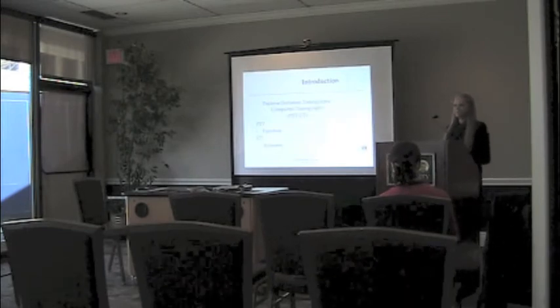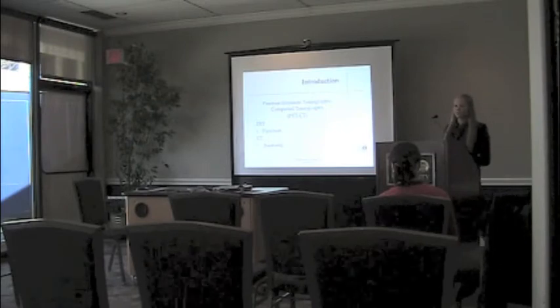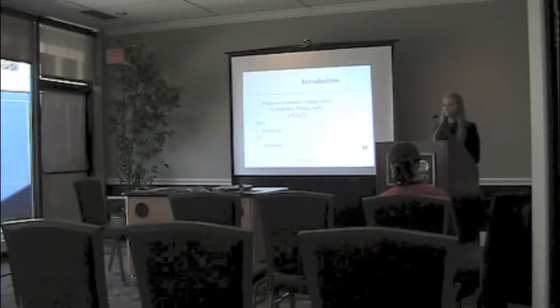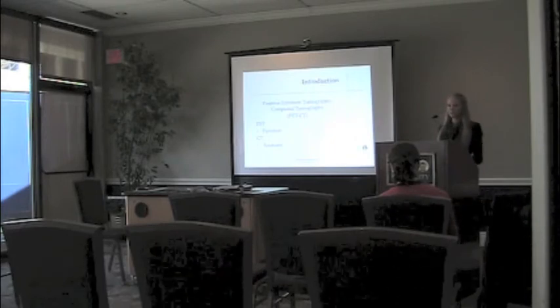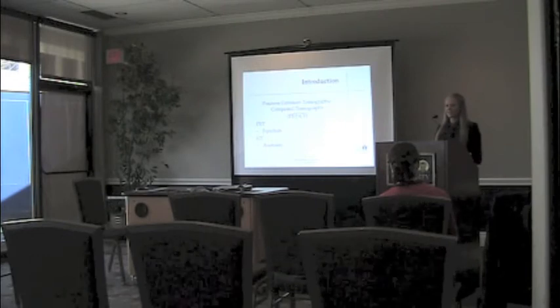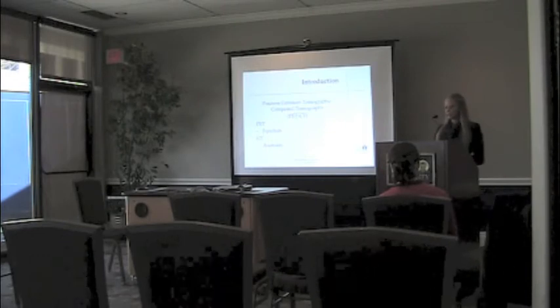And what is PET-CT? It is positron emission tomography combined with computed tomography. The PET allows us to see the function, and then the CT portion allows us to see the anatomy of the body.